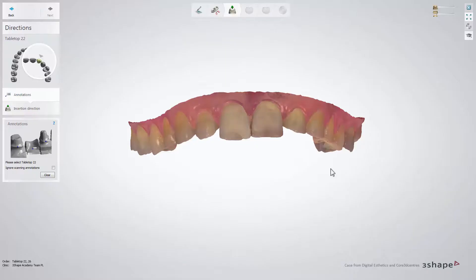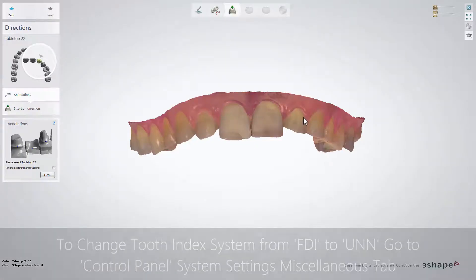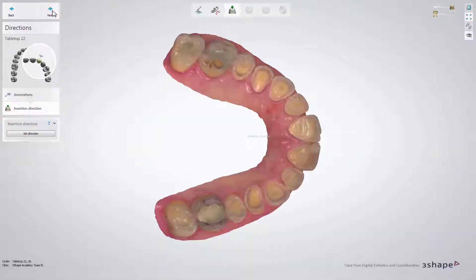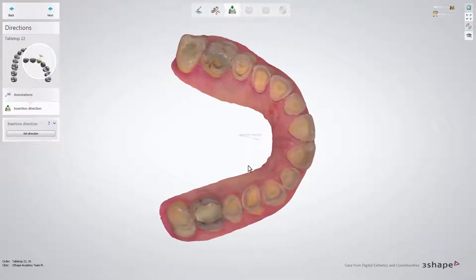When you start the tabletop design, first place the annotations on the required teeth, then click next to set the insertion direction. The software will suggest a direction, but you can choose to set it manually.